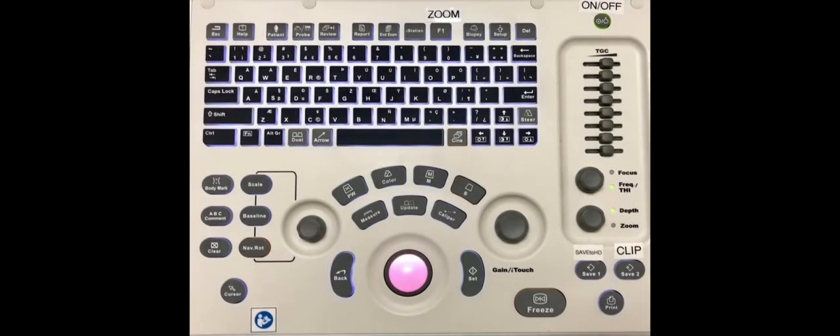In this video, we will be describing the knobs, buttons, and functions of the ultrasound machine. This is otherwise known as knobology. There are many different types of ultrasound machines. However, the basic knobs and functions are the same across all machines. In this video, we will be using the Zonare Mindray Z6.